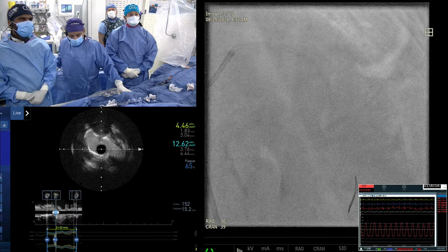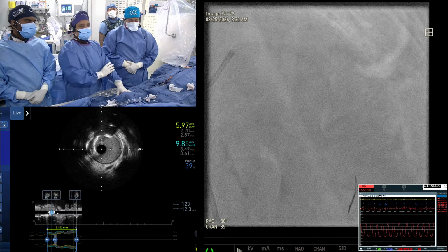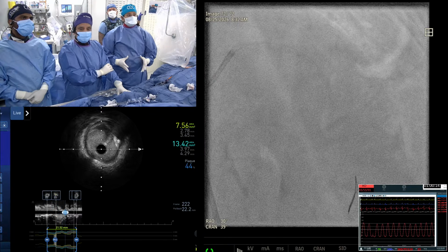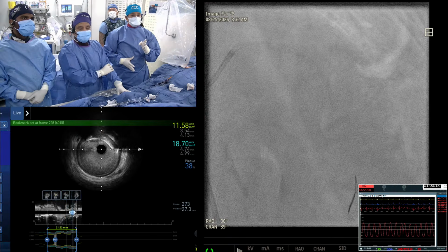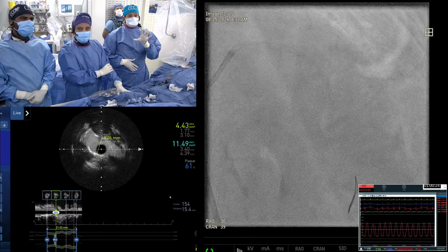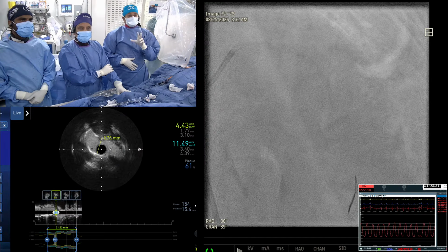We know that, but from the imaging that we have, and I think one thing everybody has to learn during our live cases is you don't have Kiski in every lab, but he does a great job teaching during these live cases exactly how to understand the imaging. We do that in our imaging live cases, but go back and show them what you're trying to tell us, that rotational atherectomy has done its part. We don't need IVL and we can just go with high pressure balloon.